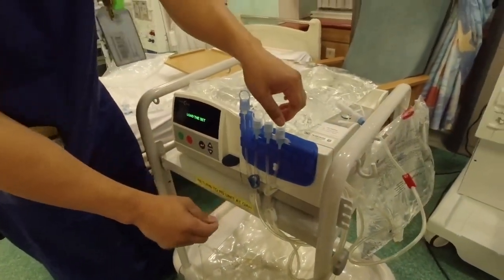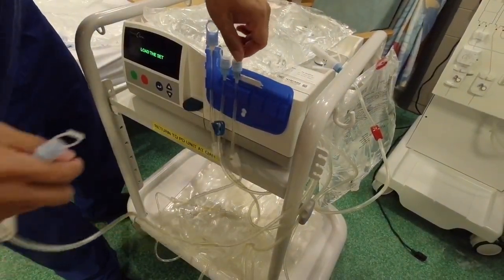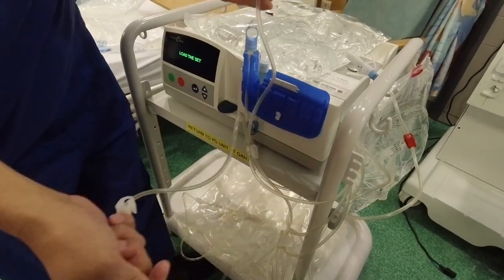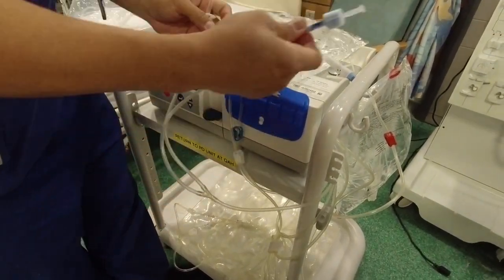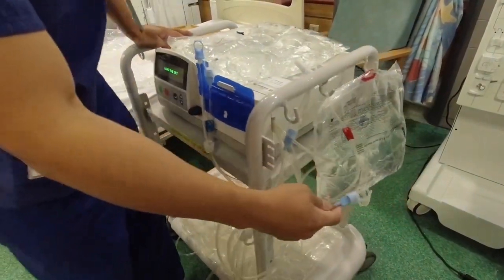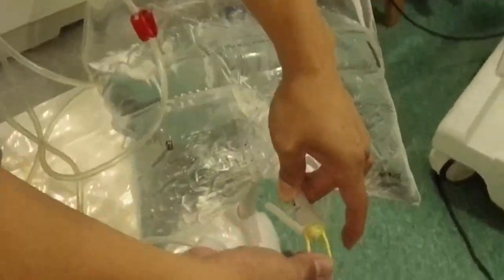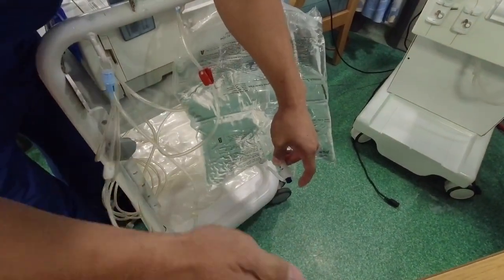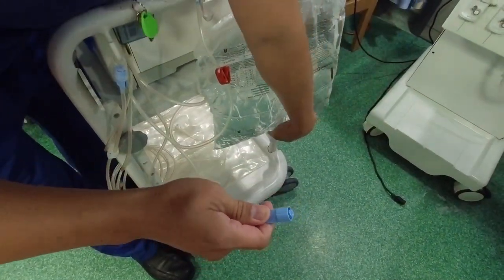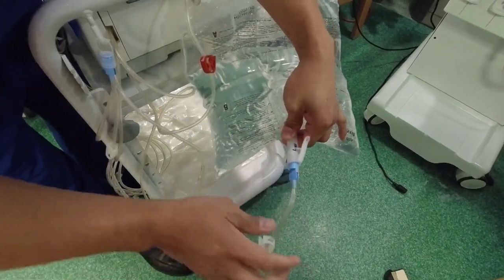Okay. Next one is your other line. So you got two pair of lines in here. So that one you don't need. So you only need one for the other bag. So this one we can hang it there. The other one goes to the second bag. So just take the yellow cup off. And then take the seal off as well. Okay, you can connect it there. Just twist it. There we go.